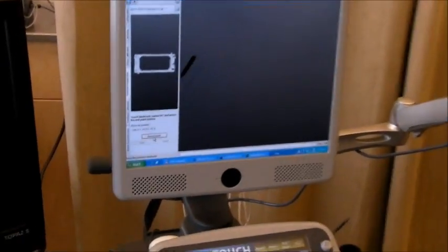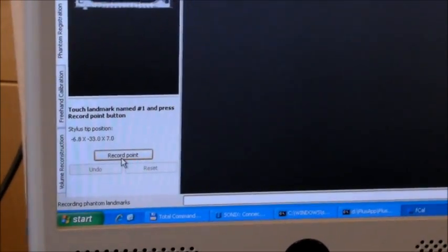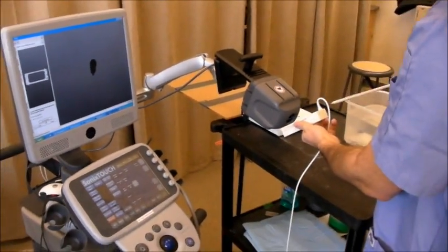It says touch landmark name one and press record button. So, I'm touching the landmark, press the point.